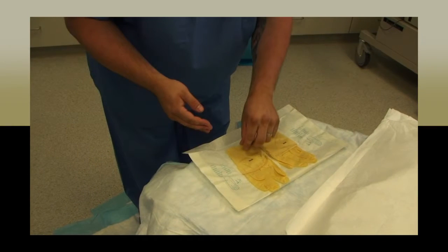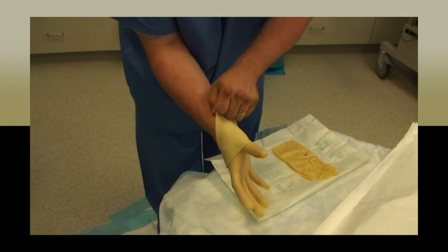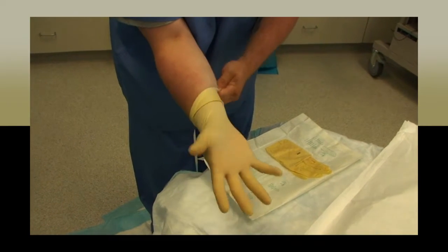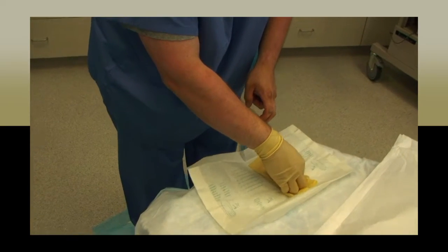You will grab the glove at the folded rim, making a closed C with the hand you will glove, and holding the glove at the folded rim with the opposite hand. You will work your hand into the glove, being careful to only touch the surface that will fold onto your wrist and arm. When one glove is on, you will reach down for the other glove with the sterile hand.